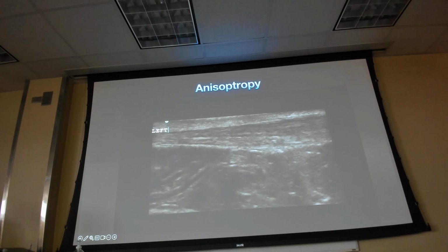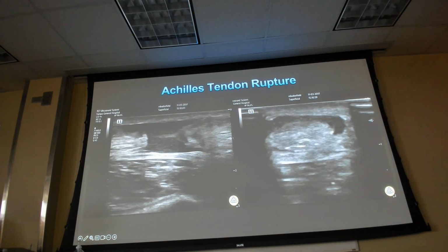So sometimes because the tissue is striated and so superficial, when there's no beam coming back to the probe, the ultrasound interprets that as dark space, and so sometimes it'll look like a tear when it isn't. In the right context, that's why we do two views. You want to look at the short axis as well to make sure you don't see that artifact and overcall something. But is it better to overcall or undercall something? Overcall all day, right? Nobody gets hurt except for your little ego, right?